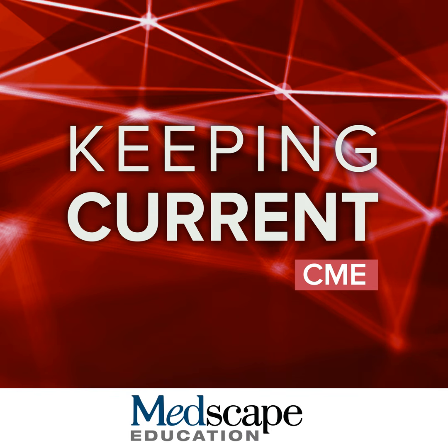Amyloid PET can be positive, as I said, 15 or 20 years before someone has symptoms of dementia. So once you're positive in that range above 30, whether that score is 30 or 100 or 150 doesn't actually predict the clinical decline. And it's really important to talk to those patients about this next step and how this relates to their overall treatment option.